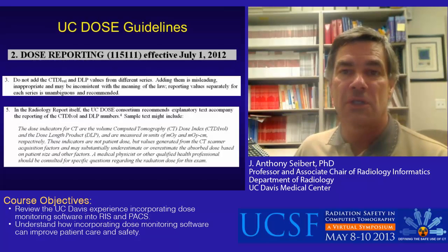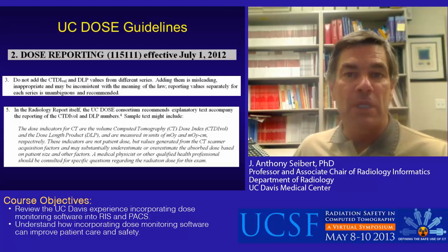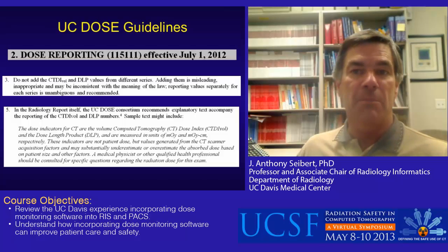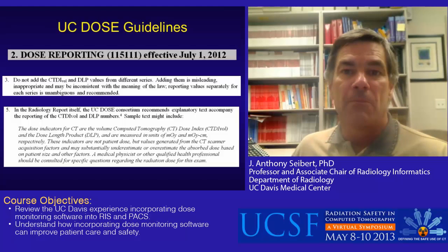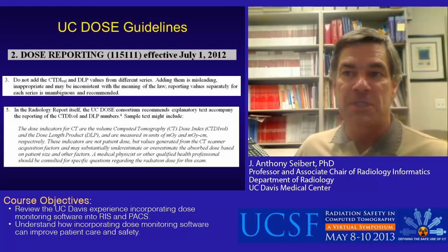Continued details include: do not add the CTDI vol and DLP from different series, as adding them can be misleading. Moreover, reporting series values separately is unambiguous and recommended. Include explanatory text. The document provides an example of some possible contents as indicated here. More will be said about its length later in this presentation.